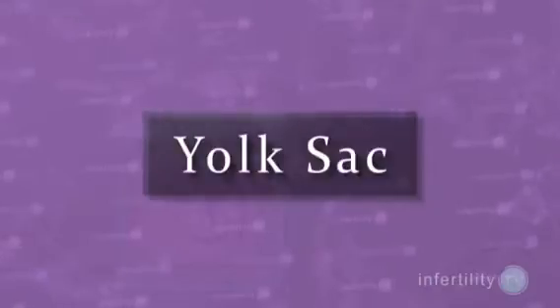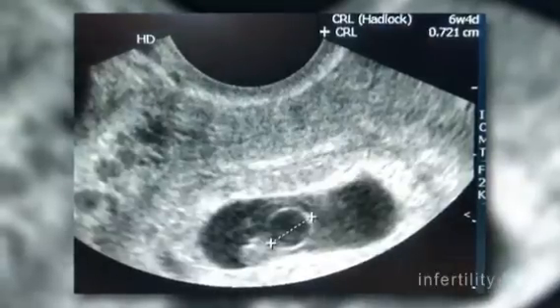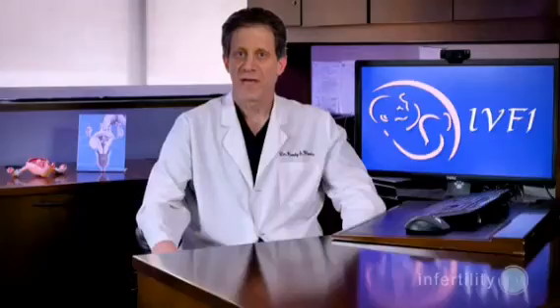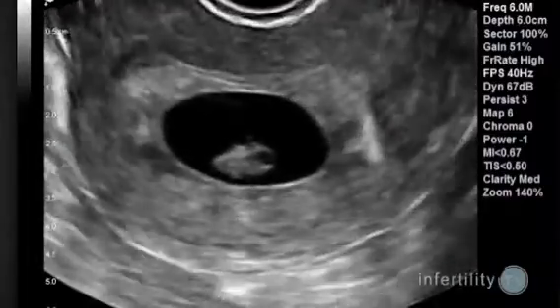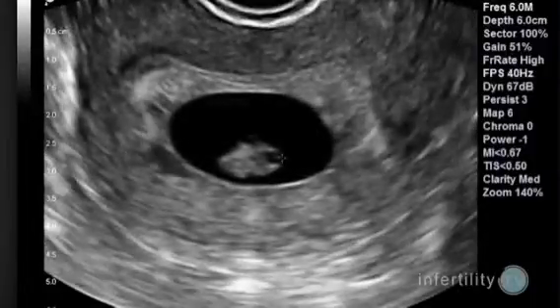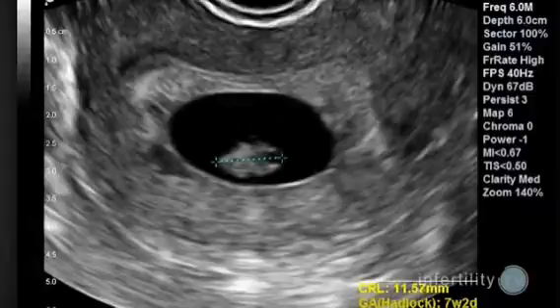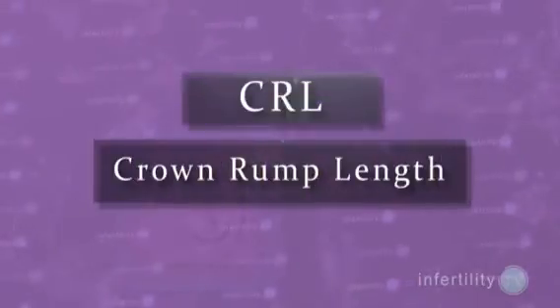The next structure that becomes visible is called the yolk sac. This appears as a white ring located inside the gestational sac. The diameter of the yolk sac can also be measured. I'll tell you why a little later. Next up is the fetus itself. On ultrasound, the developing fetus is small, white, and shaped like a bean. When we see the developing fetus, we will measure how long it is. This is referred to as the crown rump length, or CRL.